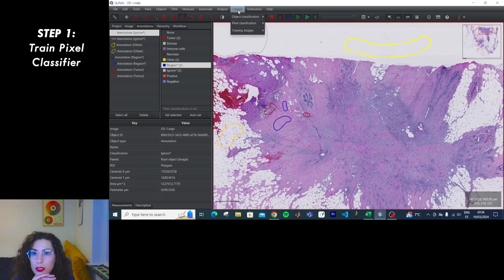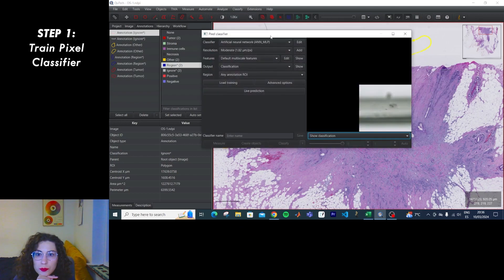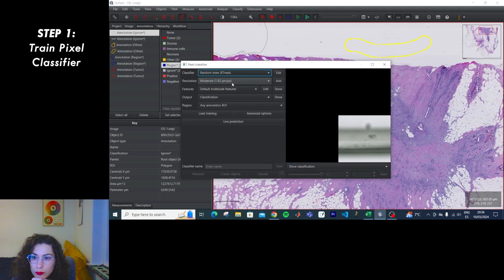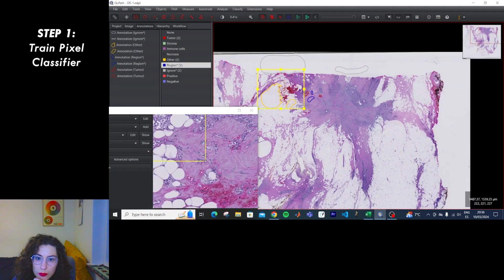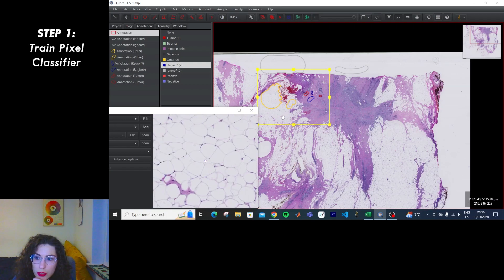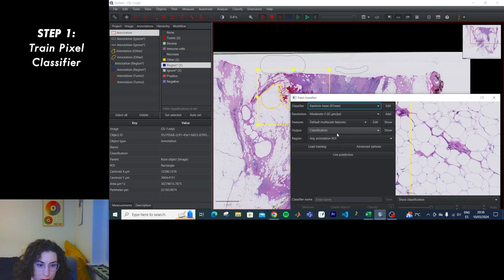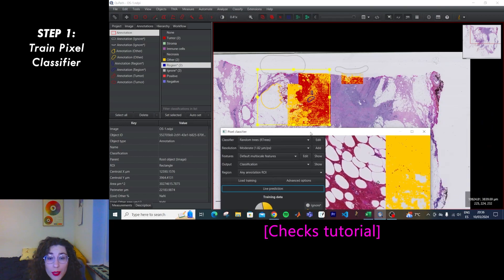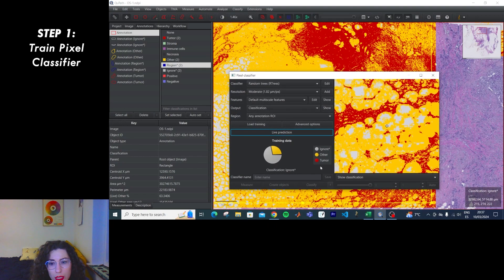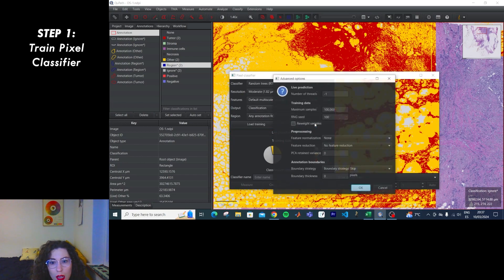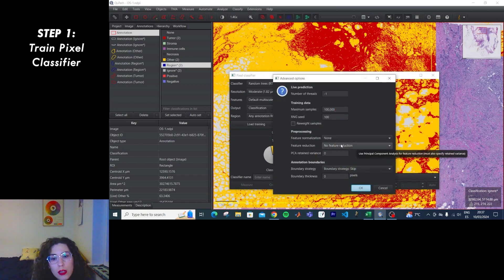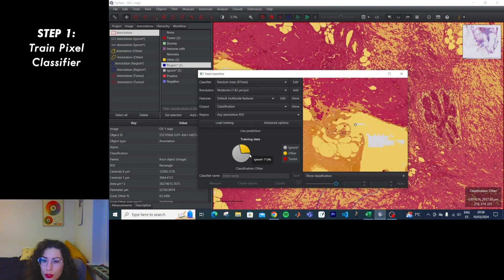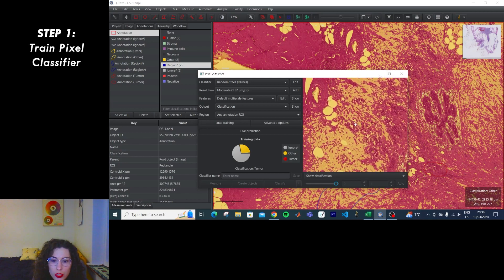Let's try pixel classification. Can I classify only that region? Oh, I broke it — oh, I didn't. Oh, it can only do two classes. I wanted more. It is ignoring the region annotation.